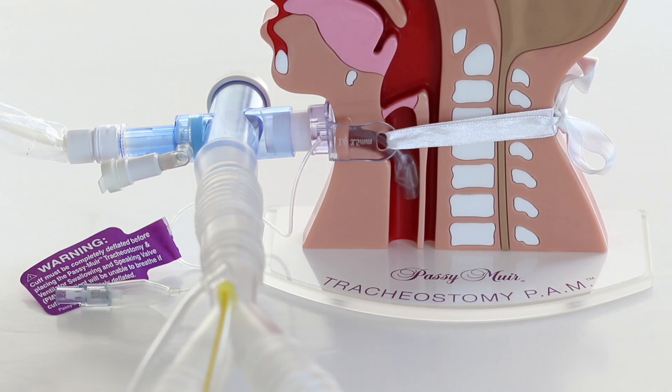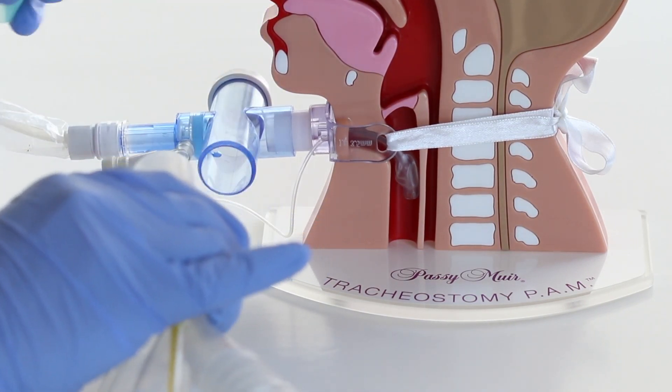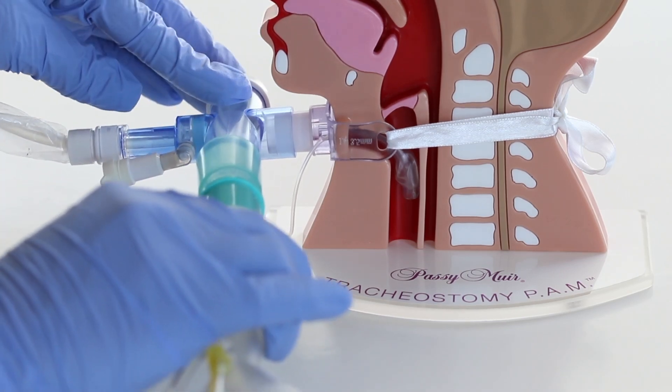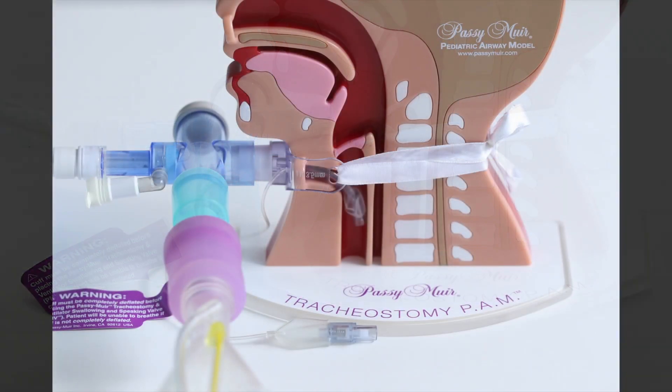Attach the 22 millimeter end of the step-down adapter to the in-line suction catheter and the PMV007 to the 15 millimeter end of the in-line suction catheter. Use 22 millimeter corrugated tubing to place the PMV into the ventilator circuit.